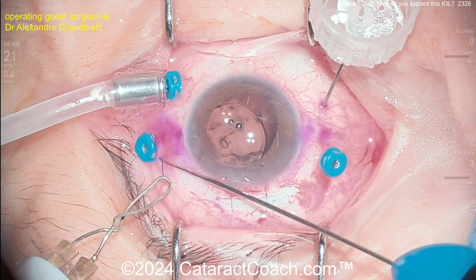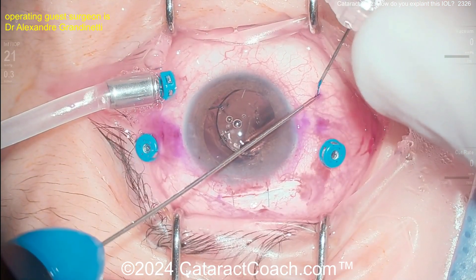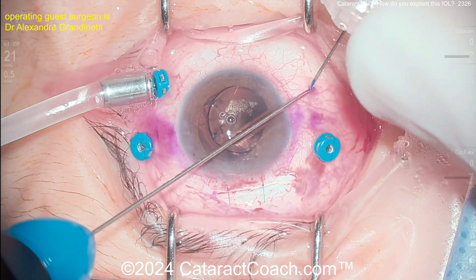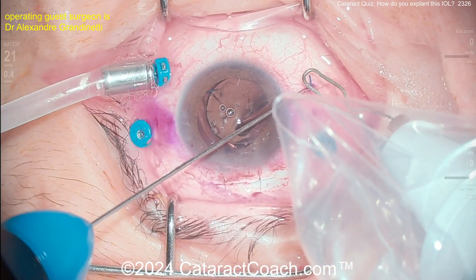Two 10-0 nylon sutures are placed to close that scleral tunnel, and it's closed out very nicely. Now finishing up with the Yamani flange technique: grabbing the haptic, creating a small flange, and getting it buried within the sclera for a beautiful outcome for this patient.